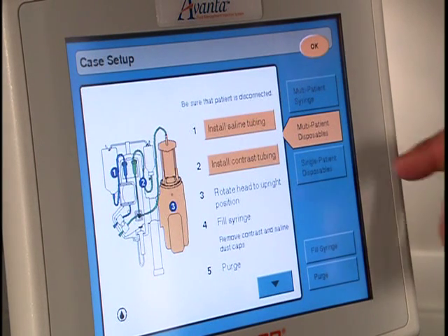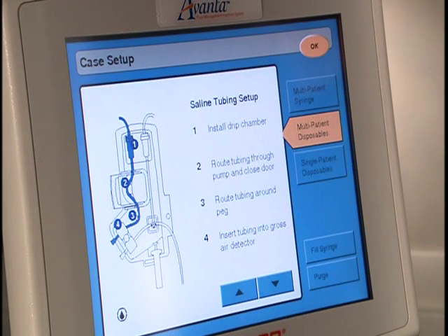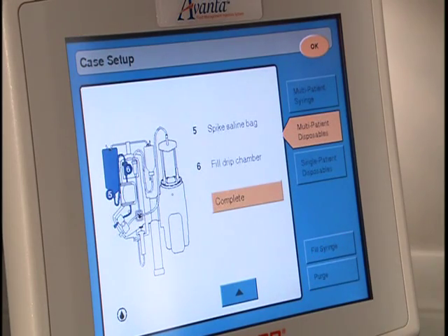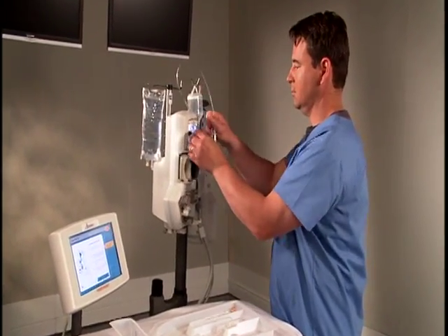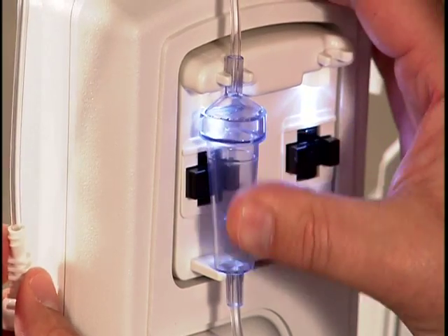Touch Step 1, Install Saline Tubing. Note the graphic representation of the flow control module and the list of numbered actions for saline tubing setup. The arrow located at the bottom of the list indicates that there are additional steps displayed on sequential screens. Perform the listed actions. Step 1. Install the drip chamber. Push the top in first, then the bottom.